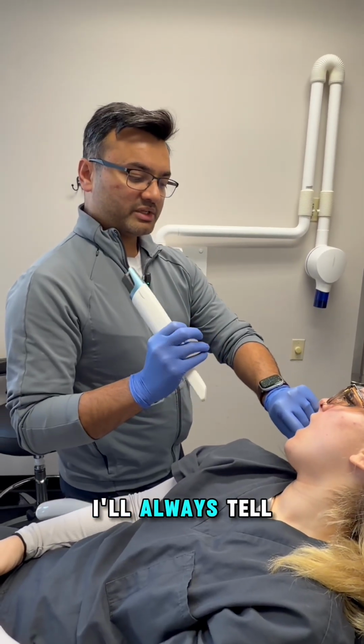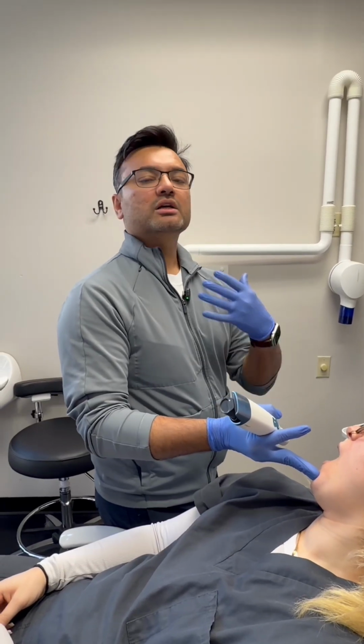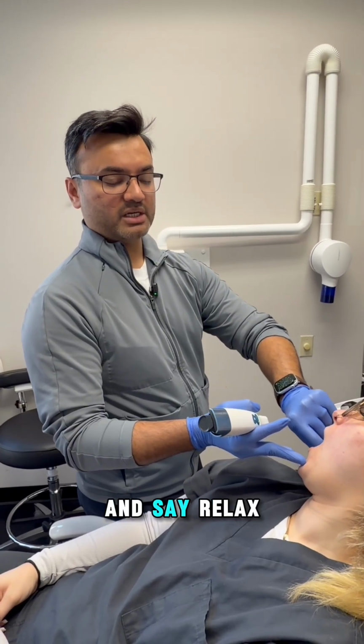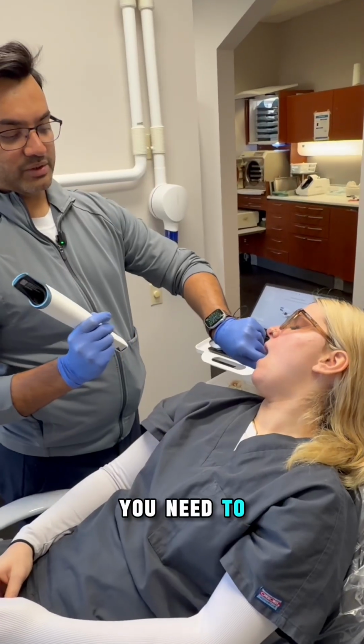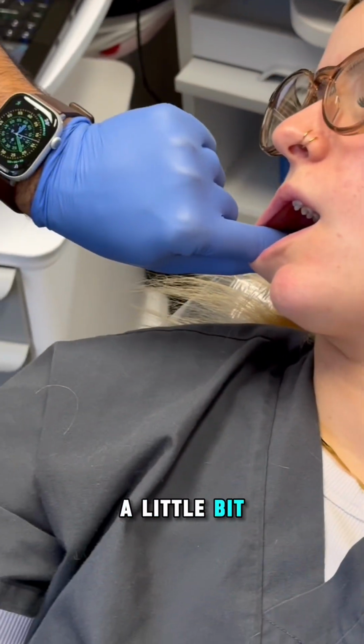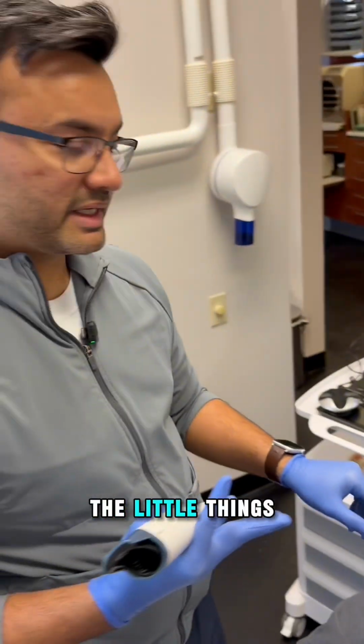Another important thing I'll always tell the patient, open wide, and the patient will always go like this. So you have to verbally tell the patients very clearly in your words, open wide, hold the cheeks and say relax. You need to have a finger in, retract the cheek a little bit, and this allows you to get access. So these are the little things that matter.